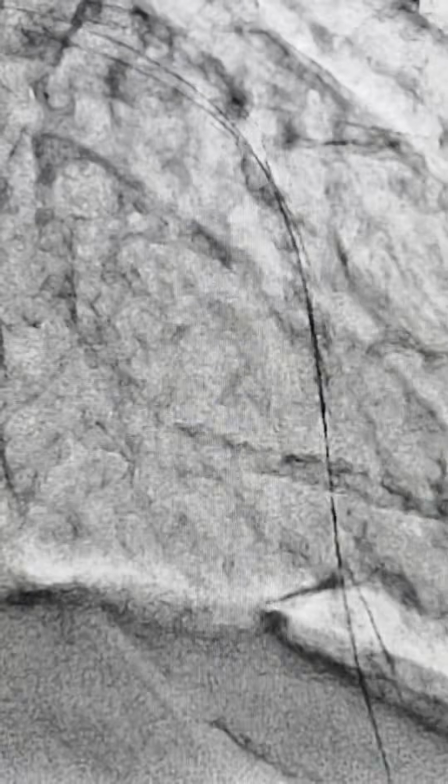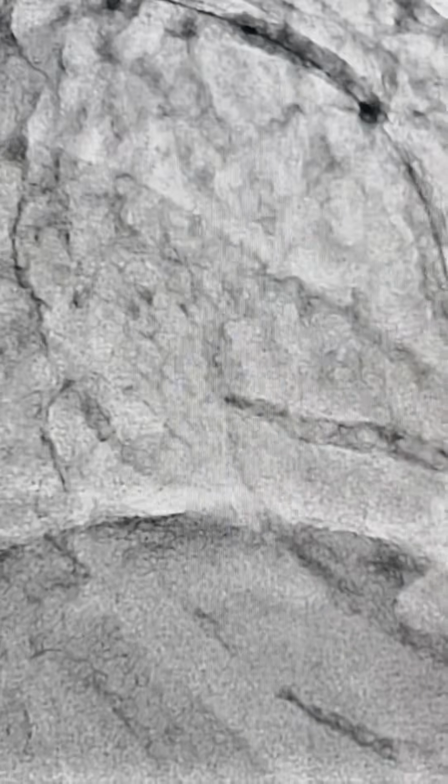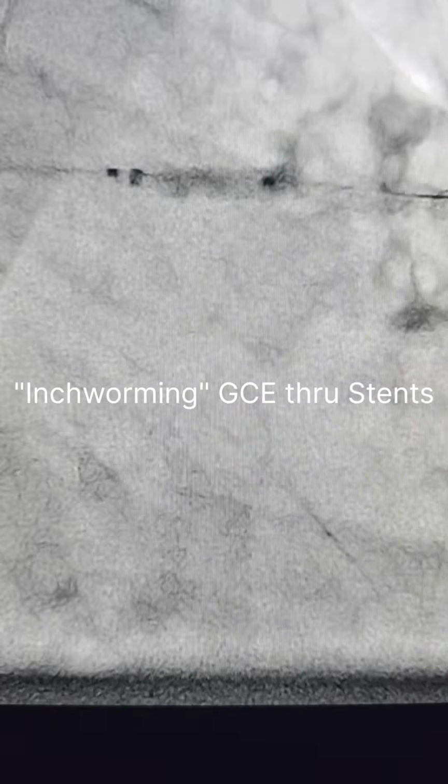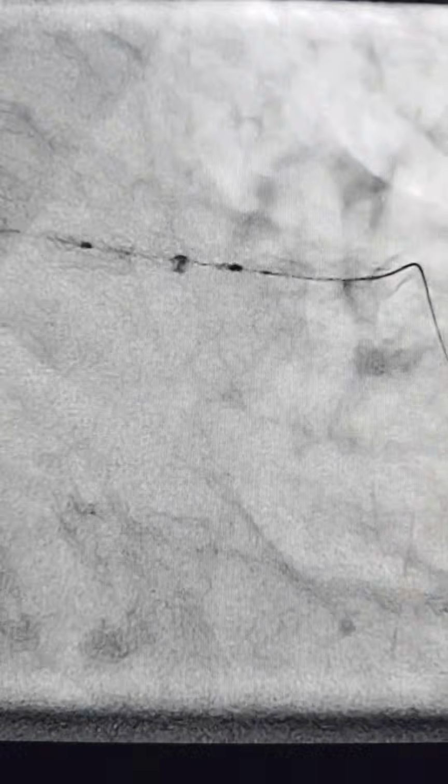So a lot of ballooning and NC balloon all the way down, and then we inchworm our way into this stent, using the balloon to inchworm the guider, the diagnostic, the guide extension all the way into the stent without causing longitudinal disruption or distortion.